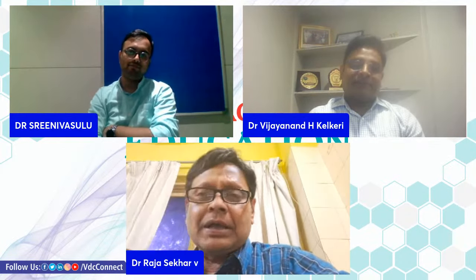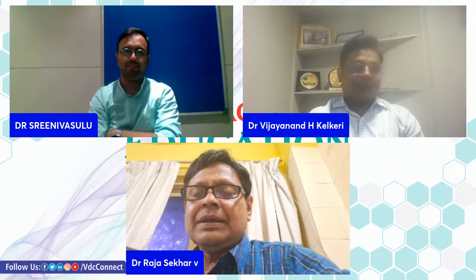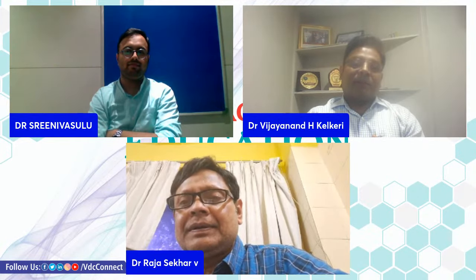And the other thing is, Dr. Vijayanand should answer my question now. Yes, sir. How early? See, on a conventional X-ray, we declare osteomyelitis when there is a periosteal reaction. Am I right? Yes. So how early can we diagnose it on MRI or CT? Which is better? Tell us, please. As early as the patient comes with the complaint, sir.